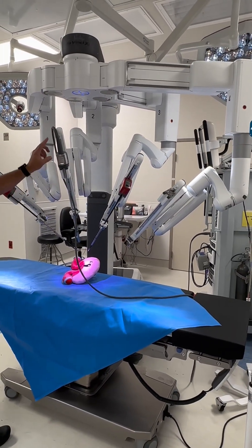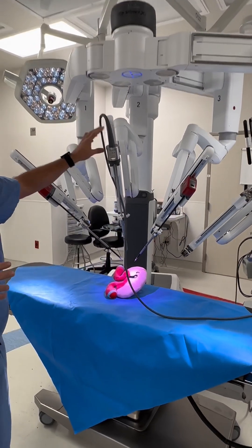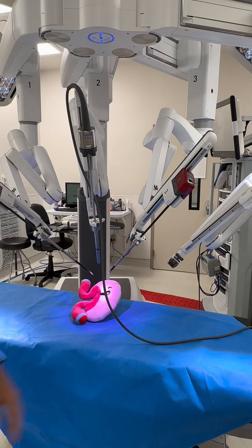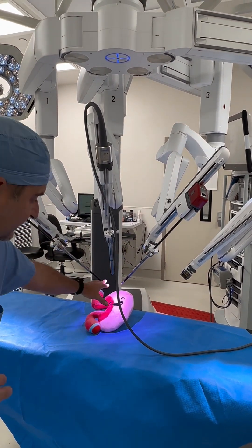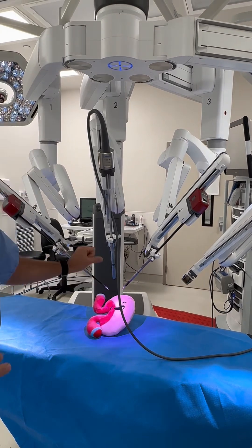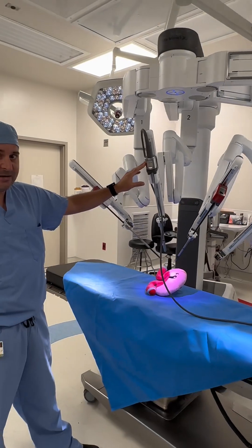Here we have a camera, and I control every part of this robot. We have a camera and three other arms, and there are many different instruments that can go in here. This is a needle driver, this is a Maryland Grasper. As a surgeon, I have many tools that I'm controlling that are hooked up to the robot here.